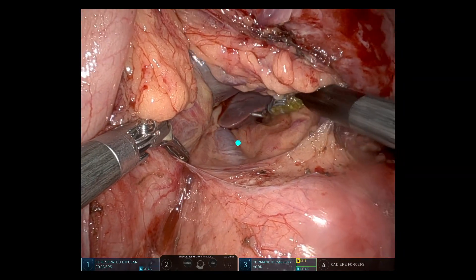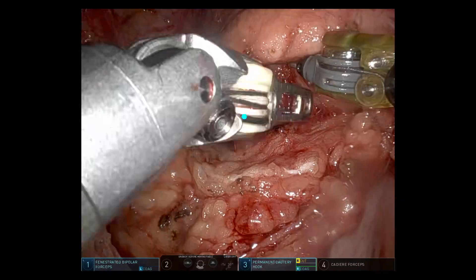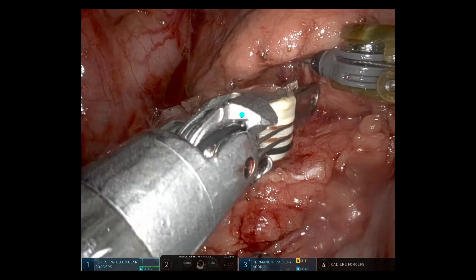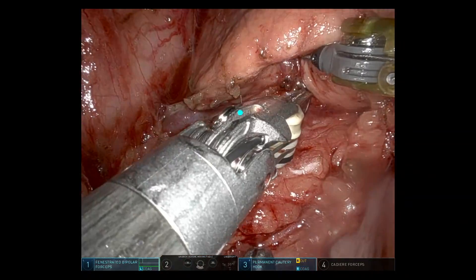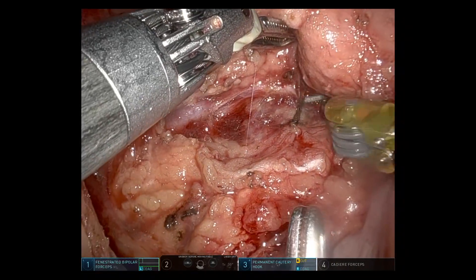You can see the portal vein entering the hilum of the liver. Working again on the lower border of the pancreas, trying to develop that tunnel — the SMV is coming into view shortly.